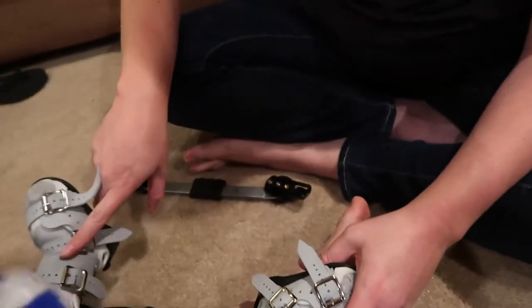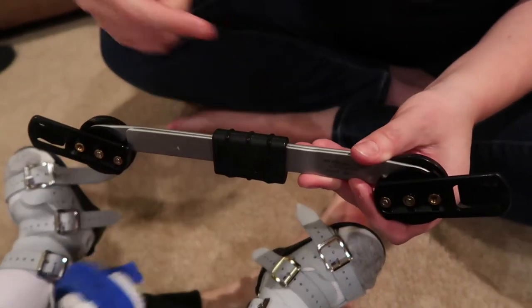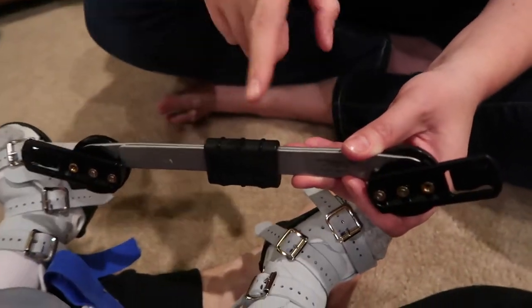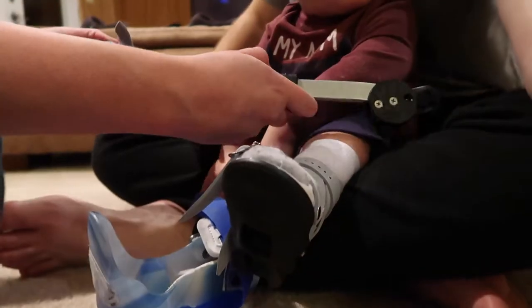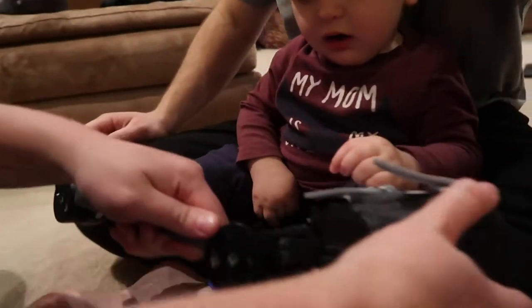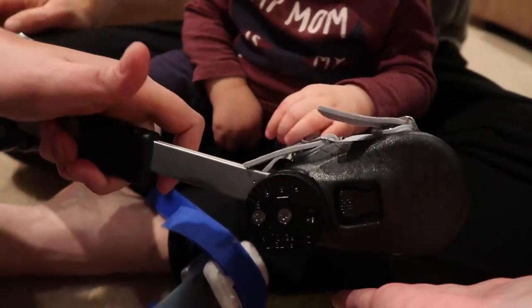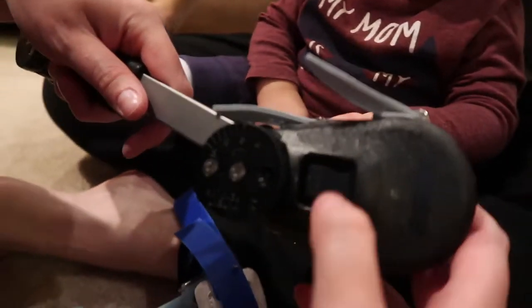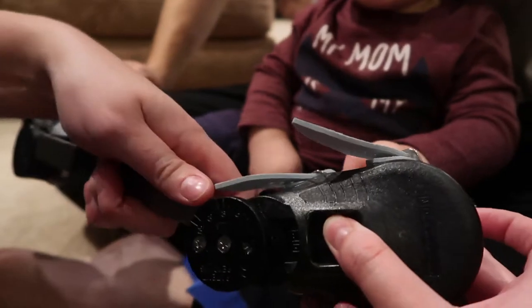Once you have both boots on, you take the bar. From Isaiah's perspective looking at it, you should be able to read 'Ponsetti.' You slide it in and it clicks. Same with this one. And then that's it. To take it off, you push while pulling the bar.